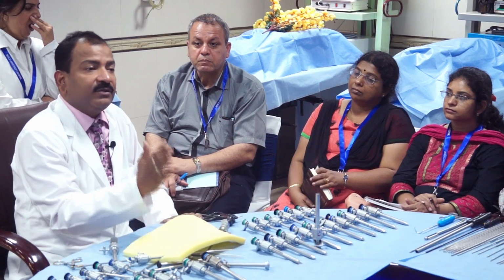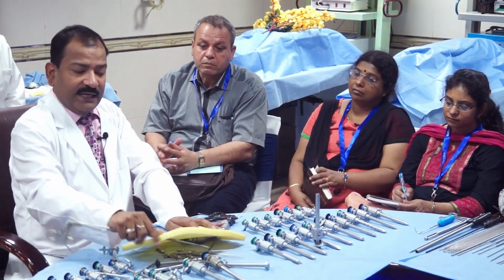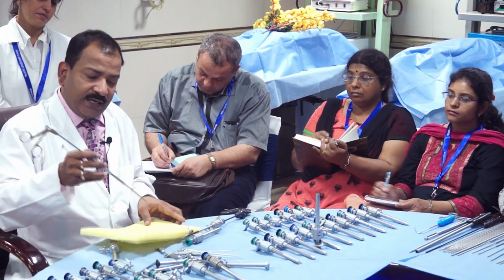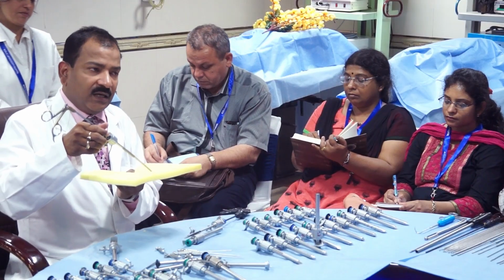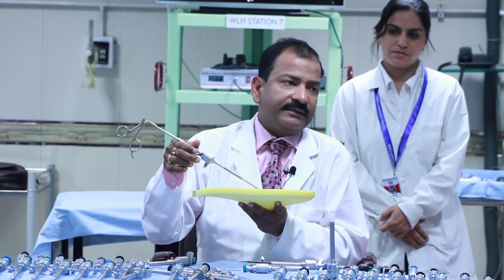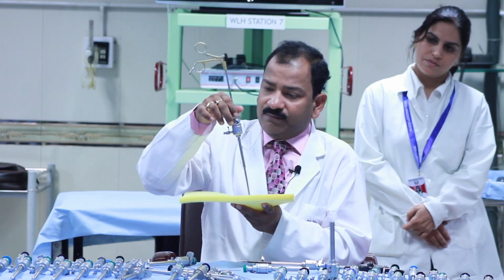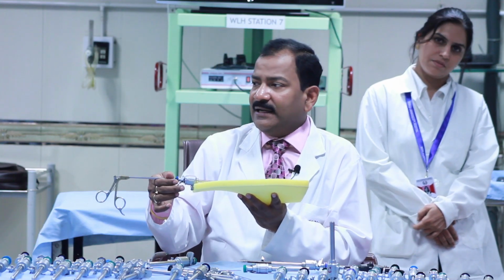So, anyway, this was the manipulation angle. After that comes the elevation angle. What is the elevation angle? This is the elevation angle. The angle between the body of the patient and the instrument. This should be 30 degrees. If it is more than 30 degrees, you will cry. And if it is less than 30 degrees, you will cry.